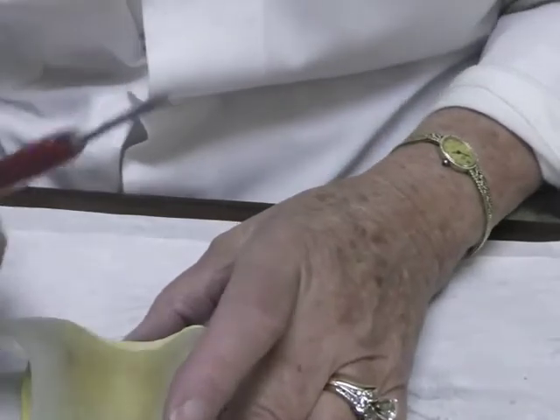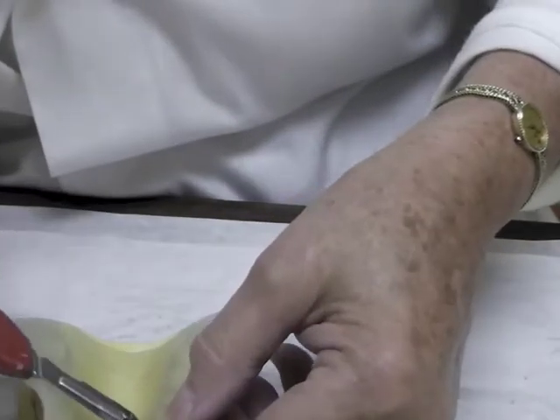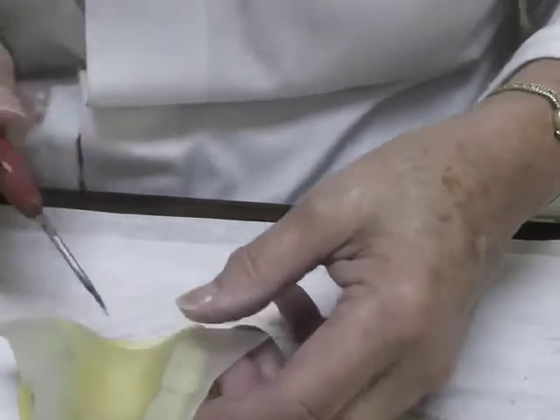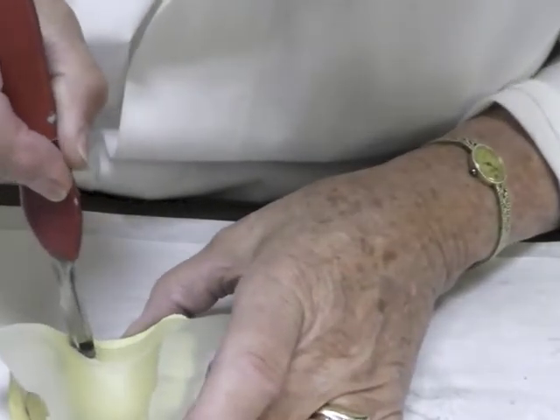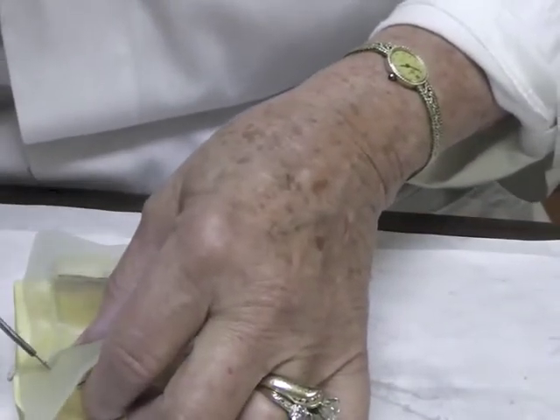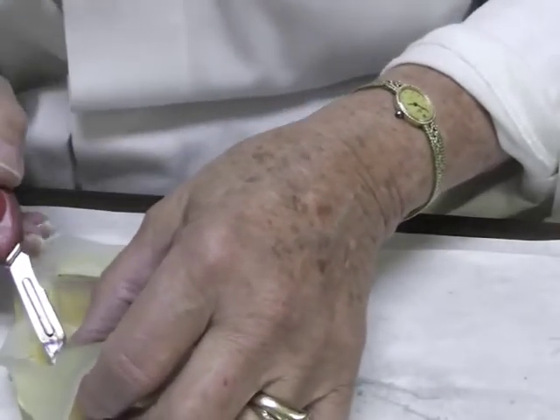Now with a Bard Parker blade and a handle, cut along the outline of your tray that you can see almost through the material right here. Cut it across the back — I'm going to leave myself a little bit too much room. And then cut it upward, move that material out of the way, and cut along the teeth.